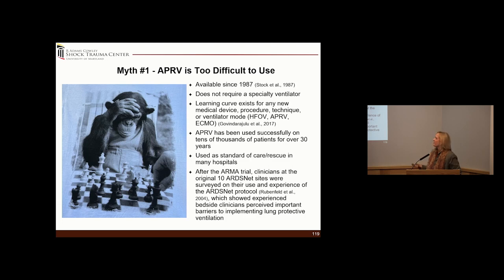The learning curve exists for anything new, anything that you try new. ECMO or high frequency, anything has a learning curve. It's been used successfully on tens of thousands of patients, over 30 years' worth. A lot of people still use it as standard of care or rescue in many hospitals.